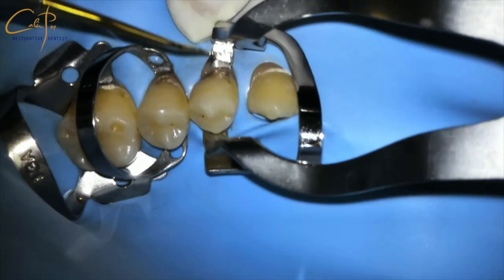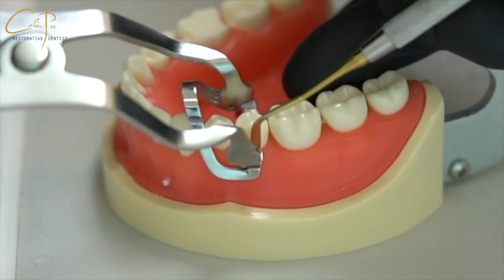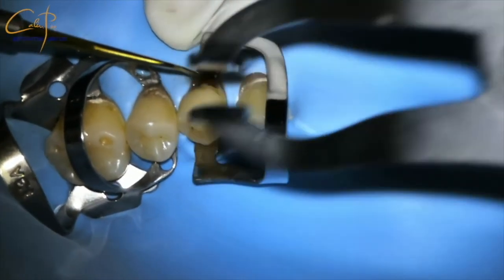I ask my assistant to use a dental mirror or a spatula to push the buccal beak into a deeper position while I am not losing the position of the lingual beak.